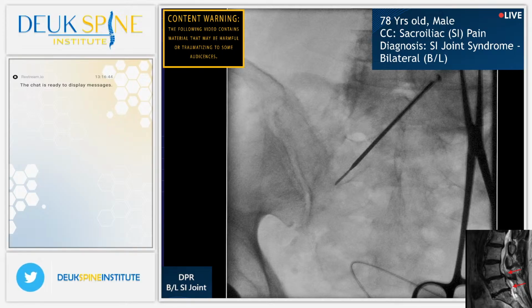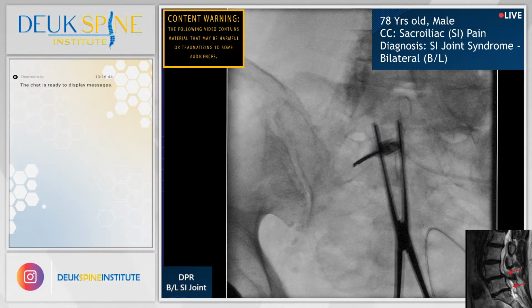That is the perfect spot to go in and get that pain nerve. Shot. Again, I'm being deflected by his anatomy, meaning being pushed over to the side.